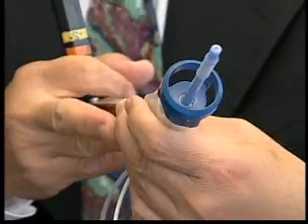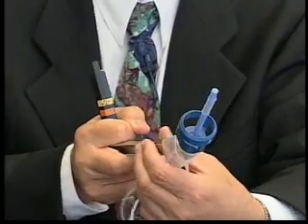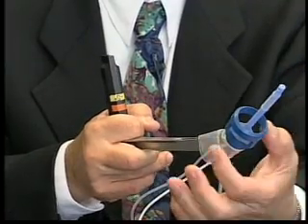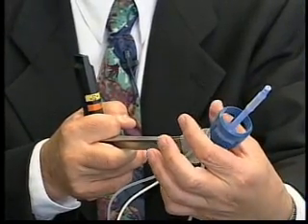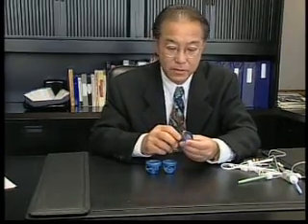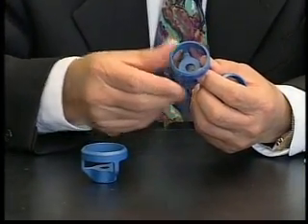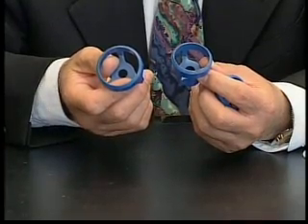It is important that the person applying the manipulator during surgery maintains pressure so that the fornix is always on stretch. This has the effect of distancing this area from the ureters coursing below. Three cup sizes are available: 2.5 cm diameter, 3 cm diameter, and 3.5 cm diameter. We have found that this covers the spectrum of cervical sizes encountered for total laparoscopic hysterectomy.